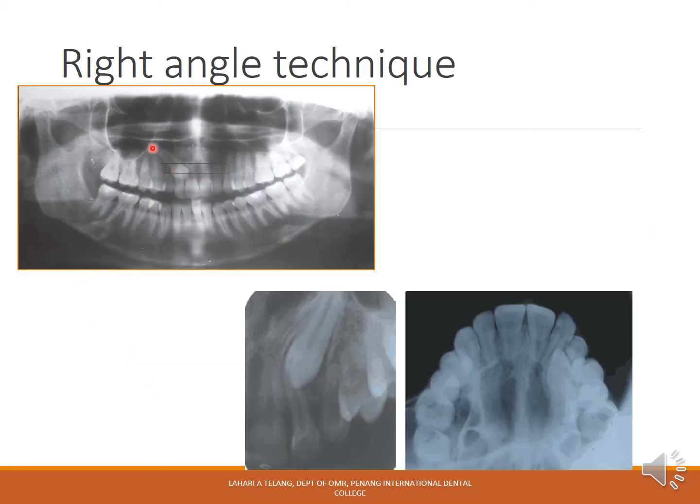If you have an impacted canine, like here in this panoramic radiograph, or you're looking at this IOPAR here with this impacted canine, this image actually doesn't tell you whether the canine is located on the lingual surface or palatal surface of the lateral incisor or is located on the buccal surface. So it's important that you take another image which is exactly at right angles to the angulation of the initial IOPAR that you've taken. That means you take a maxillary cross-sectional occlusal view, and hence it helps you determine where this canine is located.